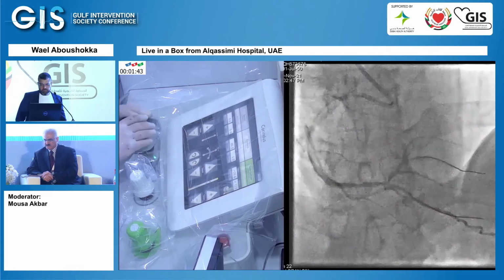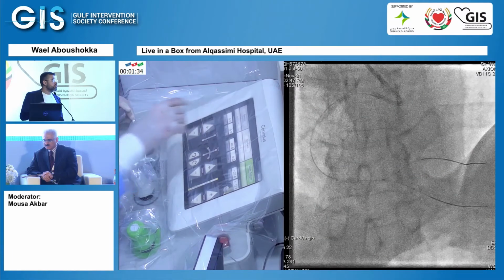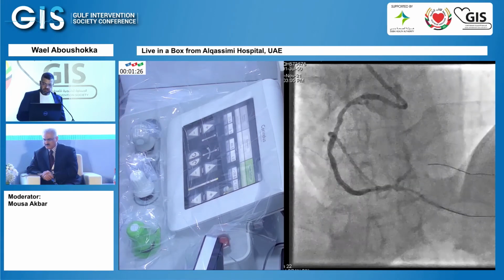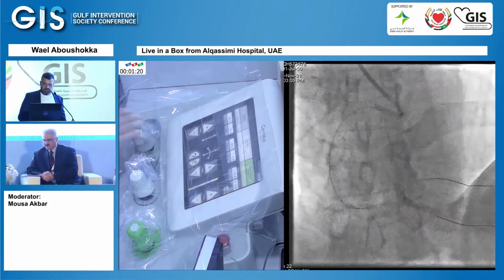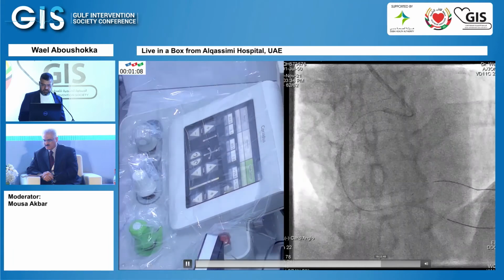I think we need to go a little bit inside from here. Okay, reset. Okay, and now each push is 1 millimeter. Oh, we can go more. Okay, so it's a 39 length, 39.3. So 40. A 2.25 by 40 stent.